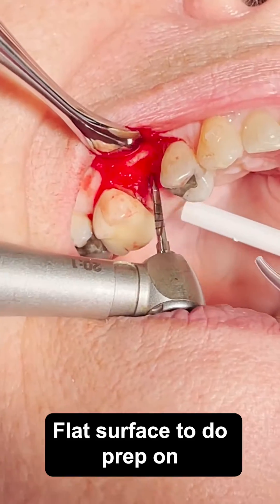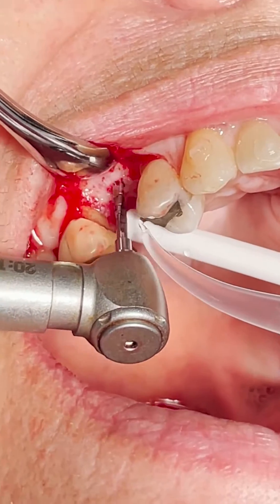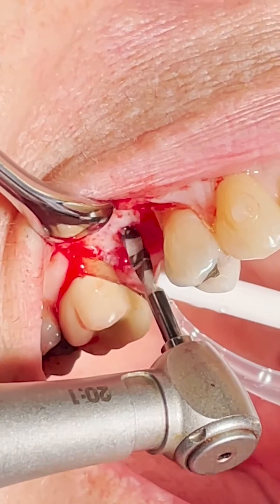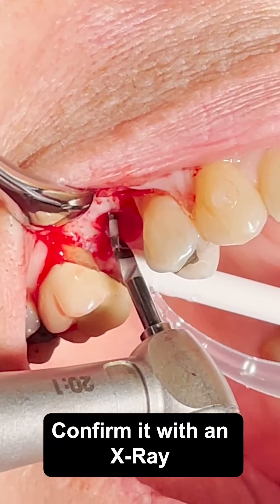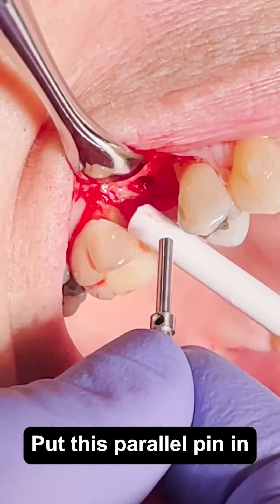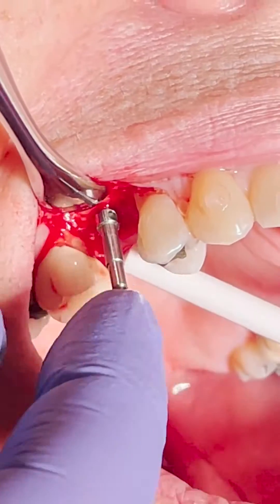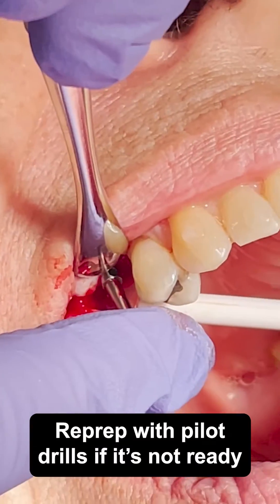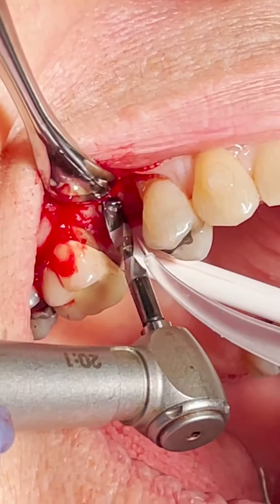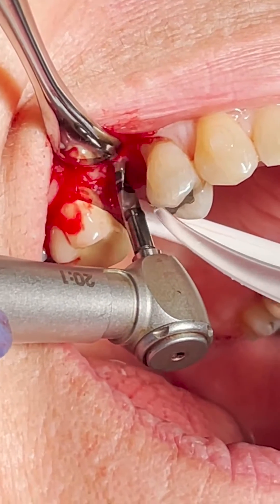Moving on to the pilot drill here, with my assistant irrigating. I'm basically taking all the drills to depth. You do want to confirm with an x-ray, so I'm putting this parallel pin in — if that looks like I'm on the right track, you keep going; otherwise, wait and re-prep with the pilot drills. Now I'm just going to finish with the bigger implant drills and that's it.